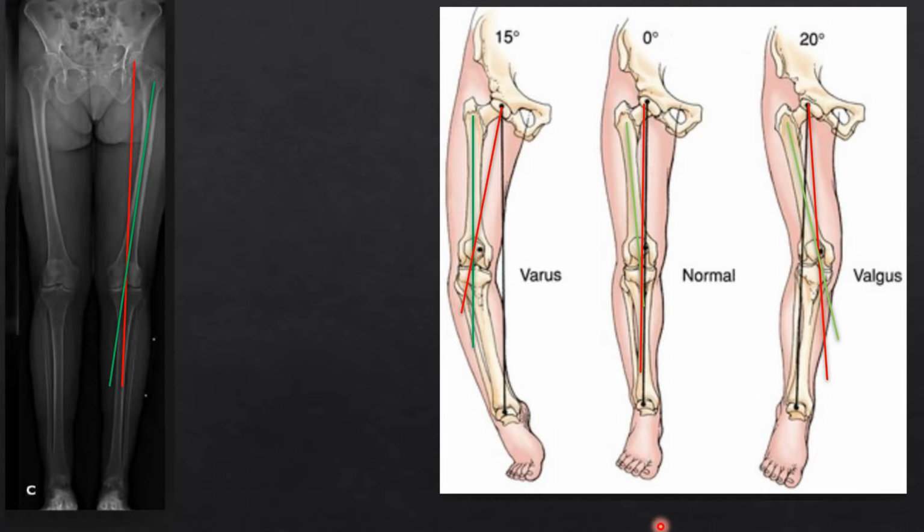And whenever we use the intramedullary jig of the femur, the distal cutting jig has to be rotated to the amount of the valgus cut angle to make the distal femoral cut perpendicular to the mechanical axis of the femur.